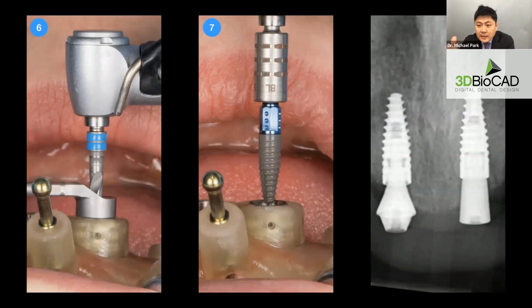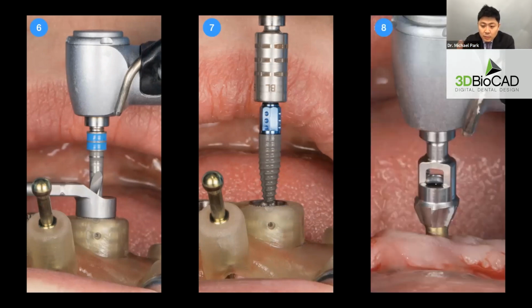But if you look, because in certain areas the implants are being placed subcrestal, the multi-unit abutment does not seat all the way. The bone is impeding the multi-unit abutment from seating all the way. So in cases like this, because we're doing flapless, we can use a bone profile drill. And I believe a lot of implant companies do have these types of bone profile drills where it's guided. So we put the guiding cylinder, screw that into the implant, and then we use the bone profile drill to profile the bone around the implant so that the multi-unit abutment can seat.